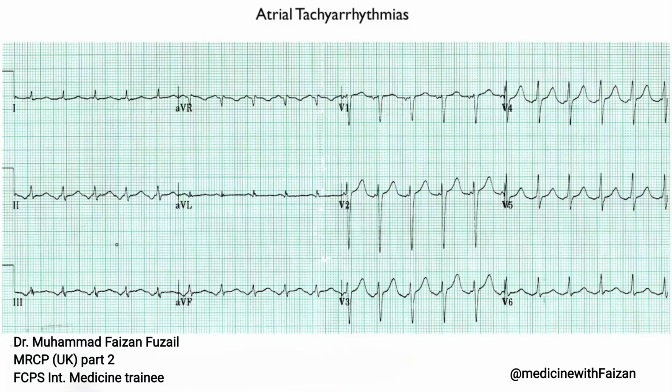Well, let me show you the first example of a sustained tachycardia, where it's unclear what the exact mechanism is, but you can at least diagnose it as supraventricular tachycardia. A patient walks into the emergency room with palpitations and lightheadedness. This is his 12-lead ECG.